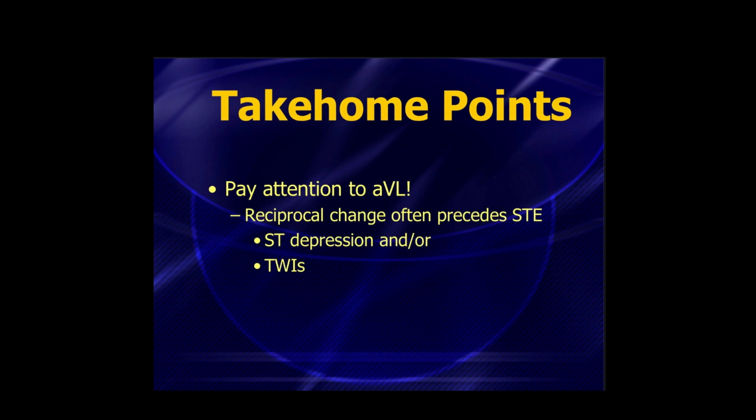So pay attention to AVL. Most people just completely ignore AVR and AVL. Those 2 leads help us a lot. We'll talk about AVR in the coming weeks, but for this week, pay attention to AVL. It is the very, very first lead to show reciprocal findings in the presence of an inferior wall STEMI. And these reciprocal changes often precede the ST elevation. Again, a key point that Marriott talked about 3 or 4 decades ago.